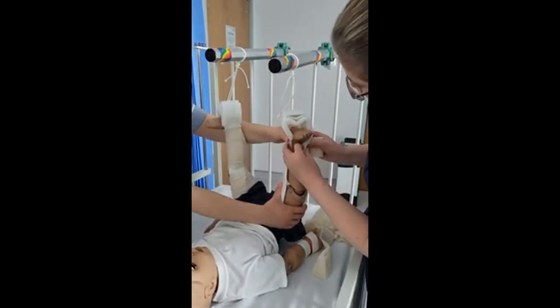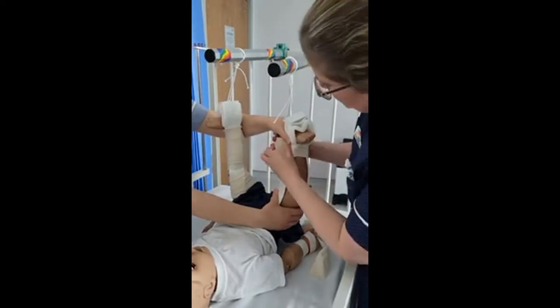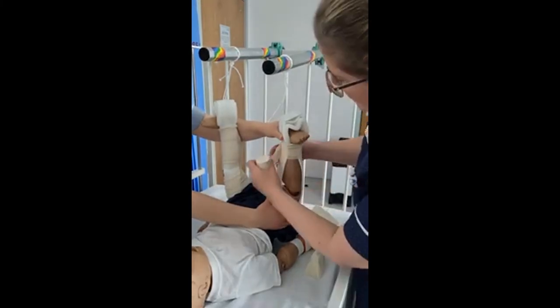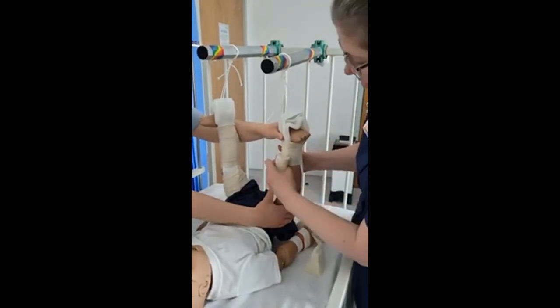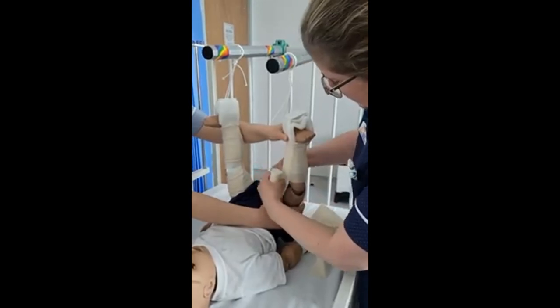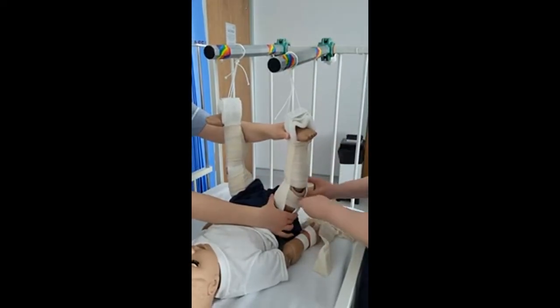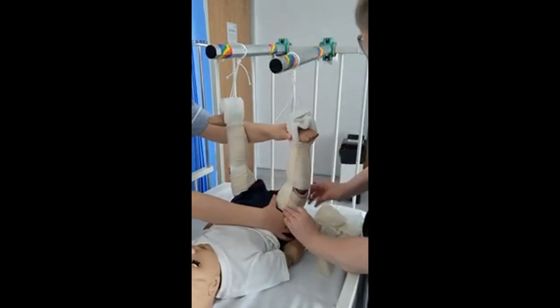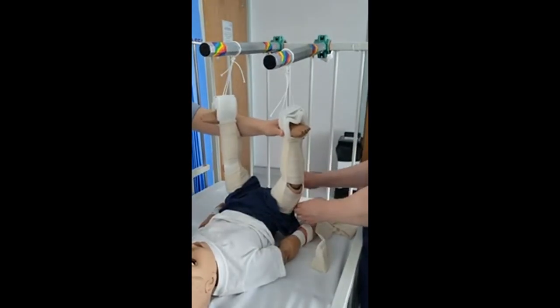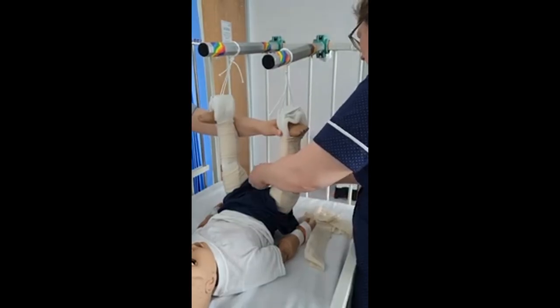Re-bandage as before, making sure the foot is in the right position in the traction. Go round twice at the ankle, and remember this shouldn't be a painful procedure — it can be a bit scary the first time for the child because they're worried it's going to hurt, so make sure they've had full pain relief. Remember you're doing 50-50 overlap and missing the back of the knee because of the main artery there. And remember when you get to the groin, you don't keep wrapping round and round — you actually cut the bandage off and tape it so that you don't over-pressurise the skin.